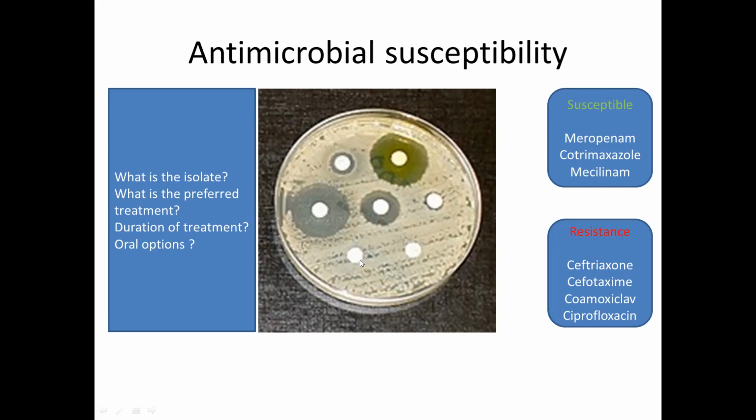If there is a test in the laboratory, we can do it by approximating ceftriaxone with co-amoxiclav, using a disc containing ceftriaxone alone or ceftriaxone with clavulanic acid, but that's not at the level we are expecting. We can observe or appreciate the keyhole appearance. But here, based on this resistance, what we have to know is what ESBL, extended spectrum beta-lactamase, is.